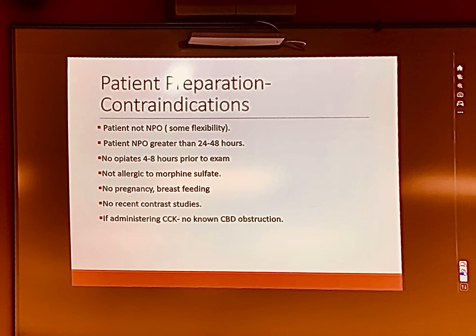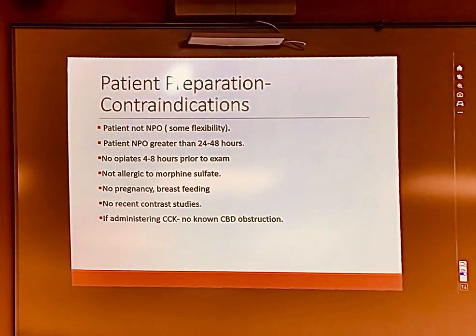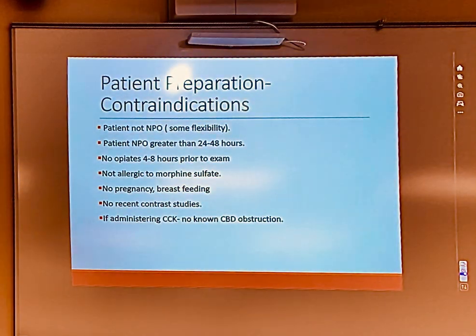And if you're administering CCK, you have to know that the patient has no CBD obstruction, common bile duct obstruction. How do you know that? Because you're waiting for at least 1 hour to be able to see liver, gallbladder, and duodenal sweep or bowel before you administer CCK on any patient.